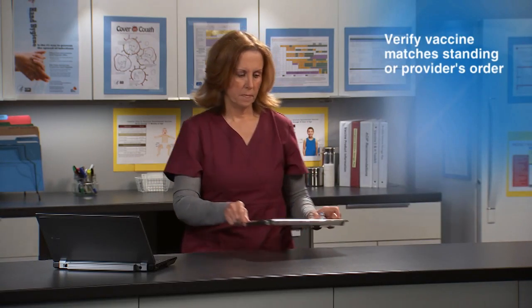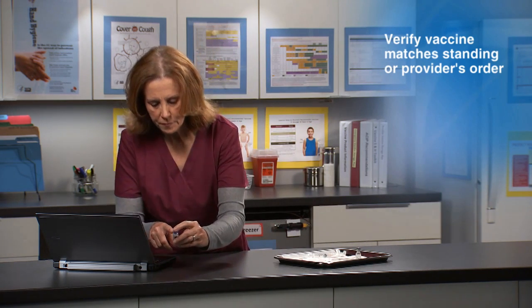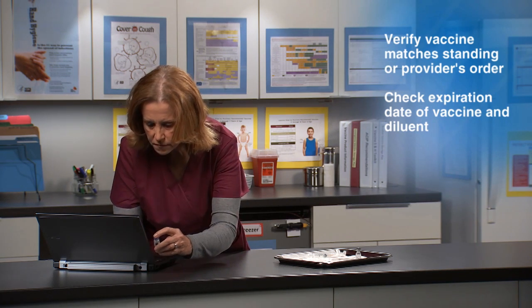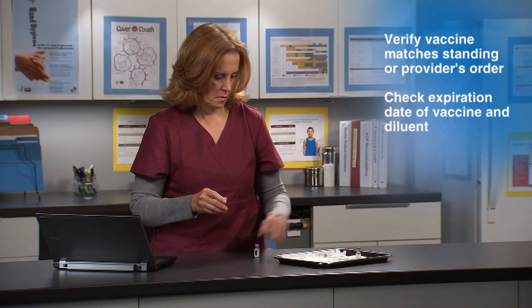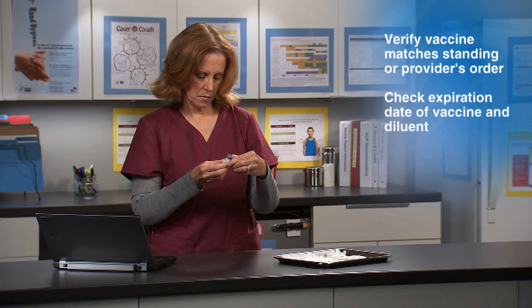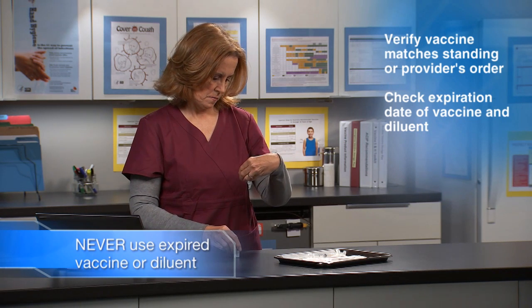Verify the vaccine you are preparing matches the standing order or provider's order. Check the vaccine and diluent to be sure you are using the correct ones. Check the expiration date on both the vaccine and diluent vials. Never use expired vaccine or diluent.